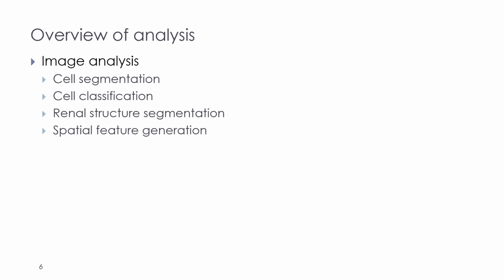While there are multiple approaches one can take for analyzing high-dimensionality datasets, we opted for a pathologist-in-the-loop approach, meaning any definitions of cell types, renal structures, or patient classifications was done in conjunction with a pathologist proficient in interpreting image features indicative of such classifications.